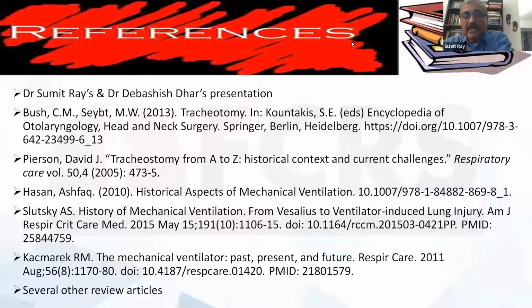And what we will also get in the near future, along with more extracorporeal removal of carbon dioxide or oxygenation, is what we call precision medicine. Subgroups will require different patterns of ventilation and support. These subgroups, the phenotypic and genotypic subgroups, are now being teased out from the biomarkers, from the way they interact with the ventilator, and from large data sets.